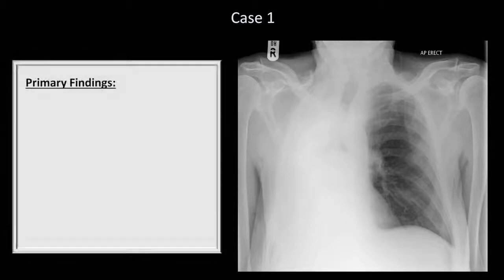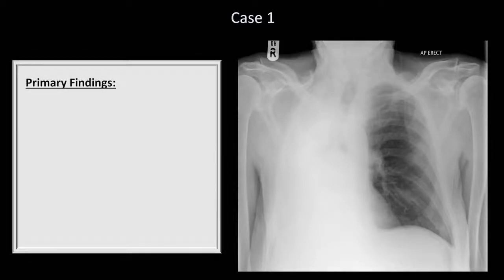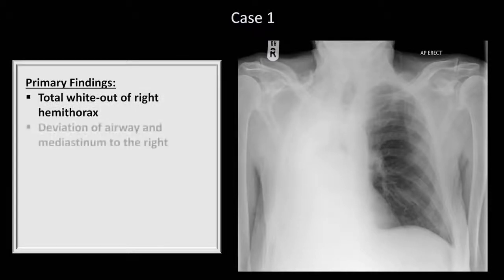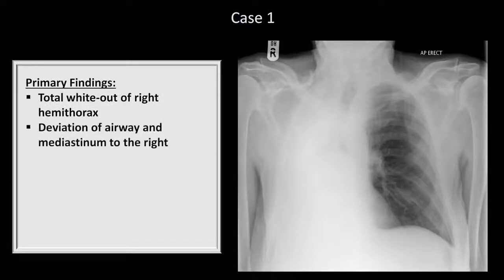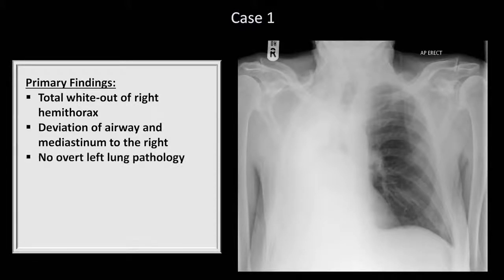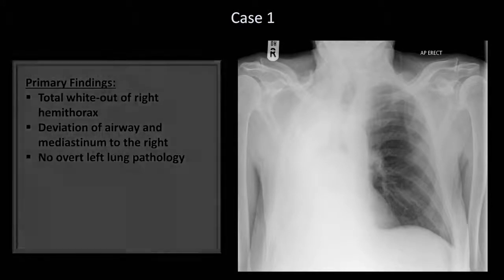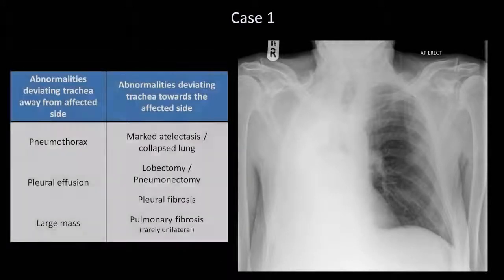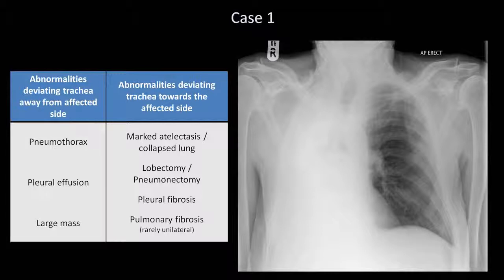Case 1. The primary radiographic finding in this first case isn't exactly subtle. There is complete whiteout of the right hemithorax with rightward deviation of the trachea, as well as the entire mediastinum. The left lung appears normal. What are some conditions that might cause this? If we pull up the differential diagnosis for tracheal shifts from Lesson 4, we see that they are divided into those which cause the trachea to be deviated away from the abnormal side, and those which cause it to be deviated towards the abnormal side, as in this case.